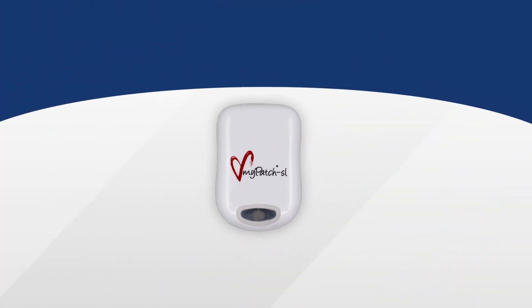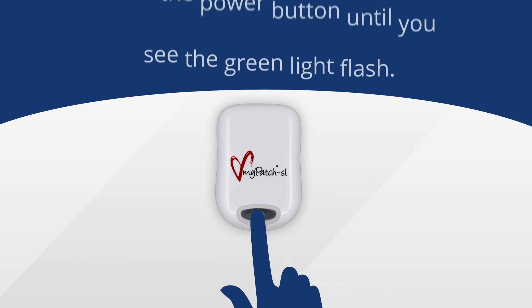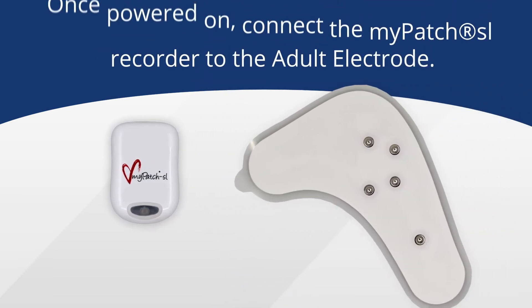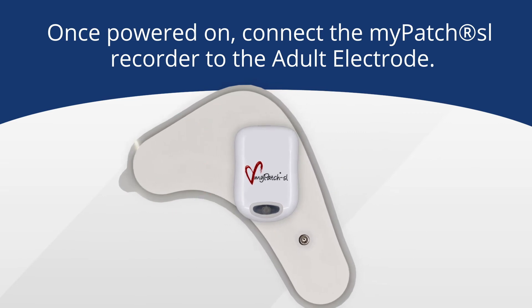You will want to ensure that your MyPatch SL recorder is properly turned on. To turn on, simply press and hold the button at the bottom of the recorder until you see the green light flash. Once it's powered on, before adhering to the chest, you'll need to attach the recorder to the electrode. The recorder only attaches one way, so line up the connectors and snap it in place.